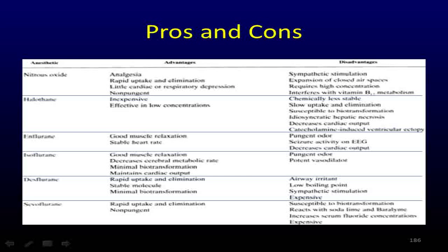Aha! But then there's desflurane. It's pressure. It is. So it won't matter. Well, it actually does matter. Here's why. It adds an actual percent based on a pressurized 1 atmosphere. So the point of it is it's heated and pressurized in order to maintain it. You're right, but it's built to deliver what it thinks is a 1 atmosphere system.